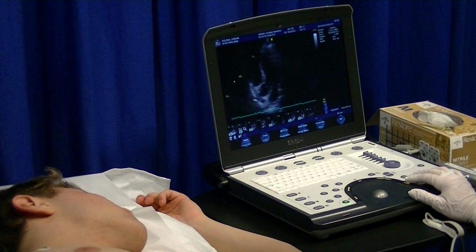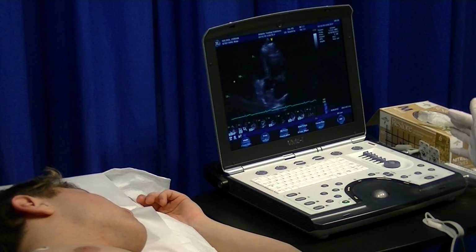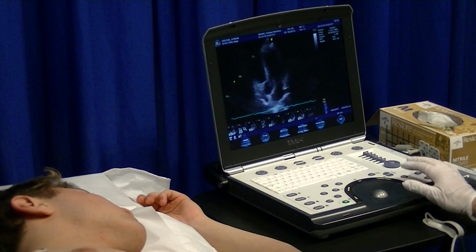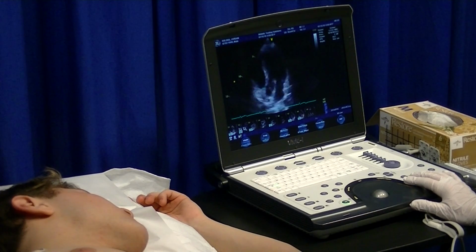Now you can deviate from this protocol anytime you feel like you are seeing something that needs further investigation. But I do ask that you do obtain each protocol picture on every scan. Typically, if there is some abnormality, the physician should be able to see it from this list of pictures we have here. Pause your breath right there.